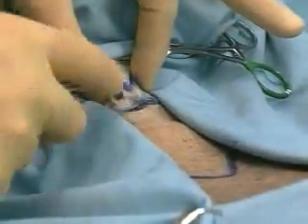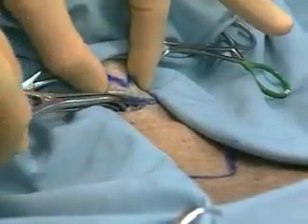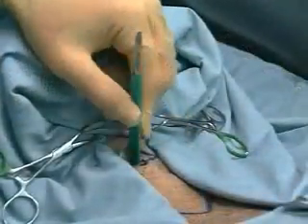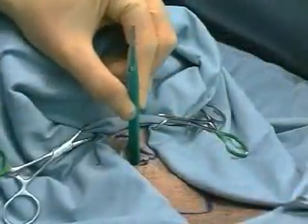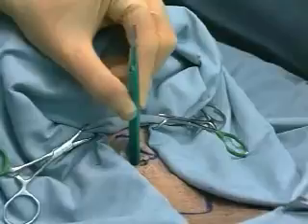Insert the tracheal spreader down the distal trachea and gently spread. Alternatively, if a tracheal spreader is not available, insert the handle of the scalpel transversely through the wound into the trachea. Rotate the scalpel handle 90 degrees to enlarge the opening in the cricothyroid membrane.